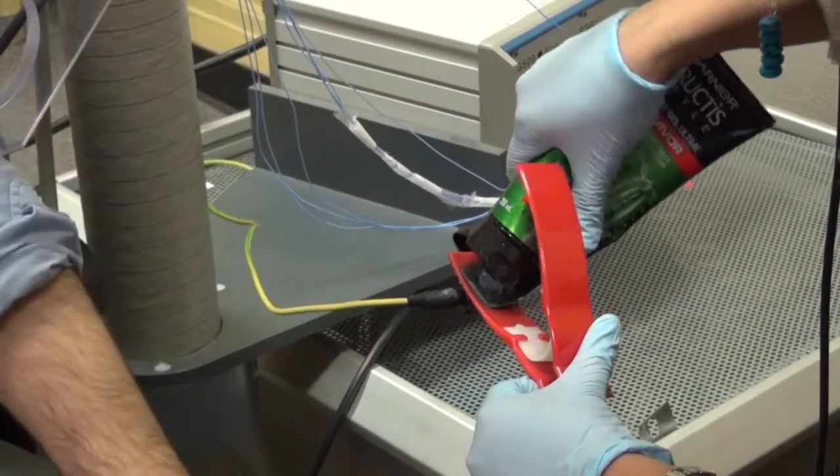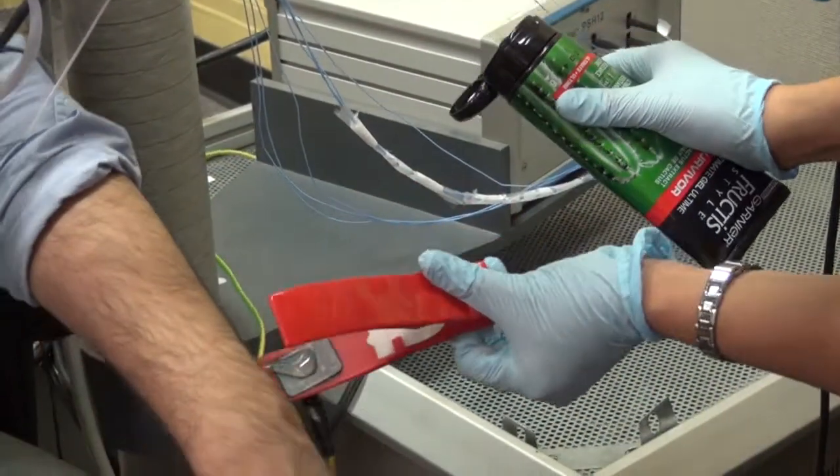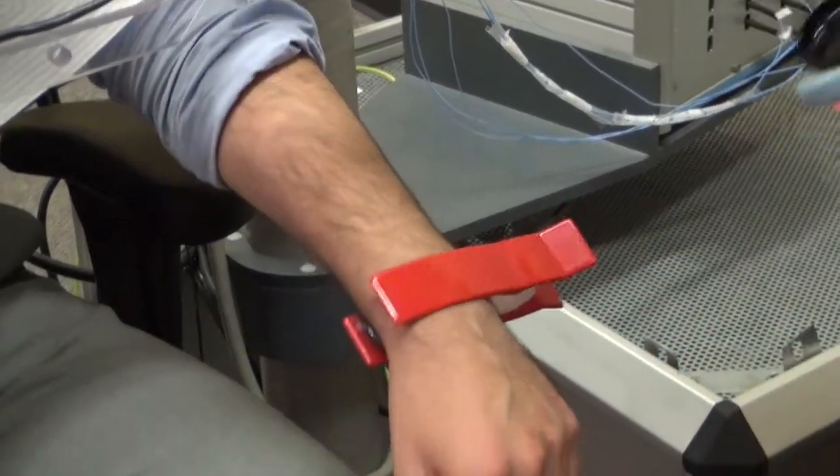The participant is also grounded with an ankle or wrist lead in order to reduce interference in the data.